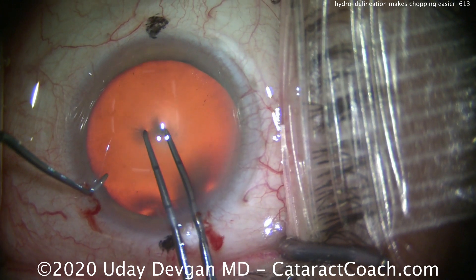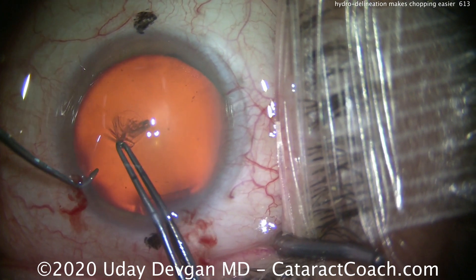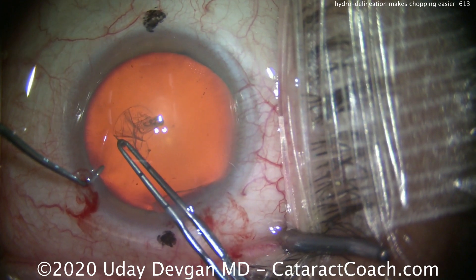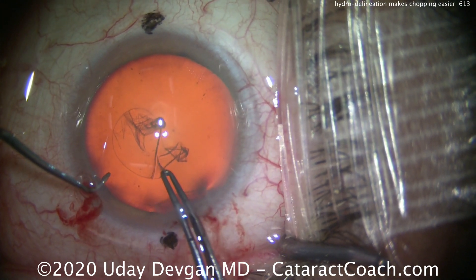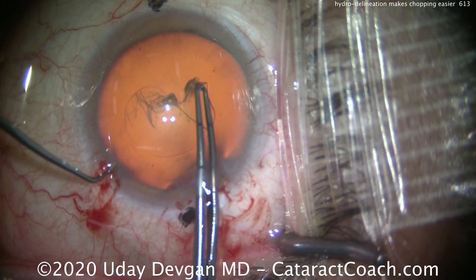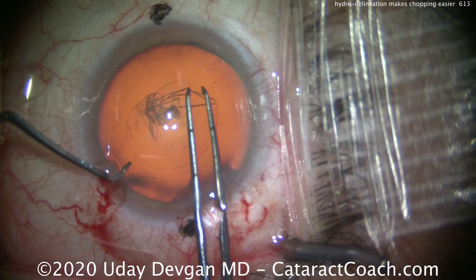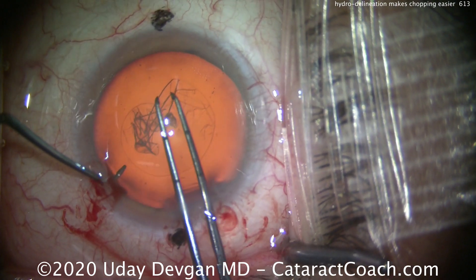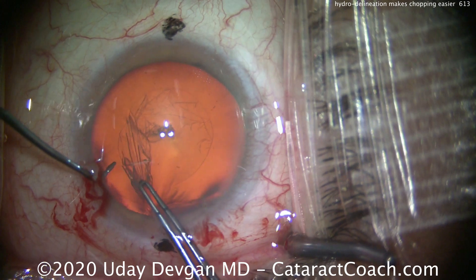Here's our nucleus. We're holding the eye still. We're going to create a nice 5mm capsulorrhexis here. Now what's the diameter of the nucleus? It's about 9 or 10mm. And so if we just do hydrodissection, we have to chop this large 9mm nucleus, and the halves or quarters that we create are quite large. That makes it difficult to bring them outside the capsular opening, outside this capsulorrhexis — they have to fit through this small 5mm opening.